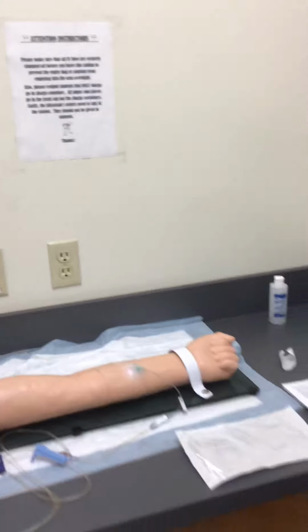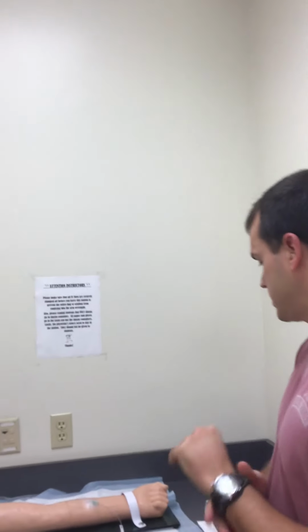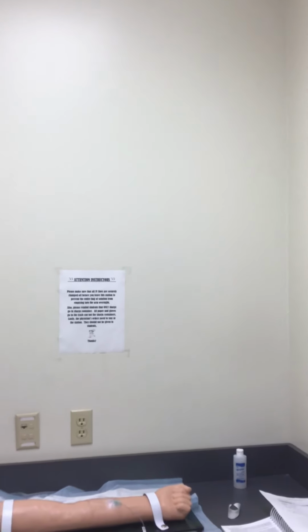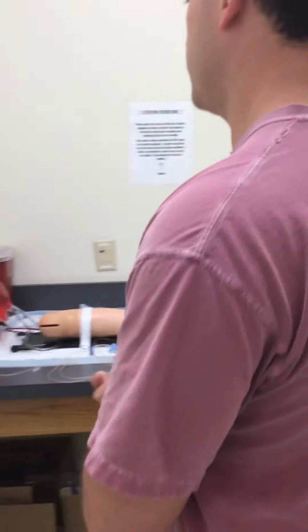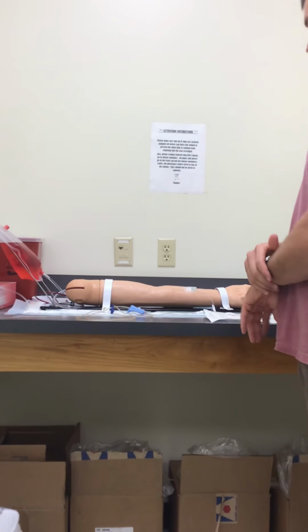All right. Once I've done this, I can reassess the site, make sure my patient is comfortable, and leave for 30 minutes. After 30 minutes, I come back, reassess the site, and make sure my patient's comfortable.